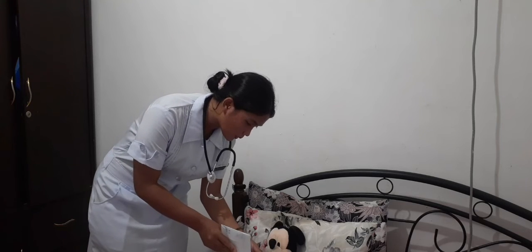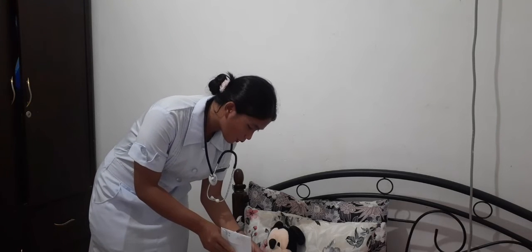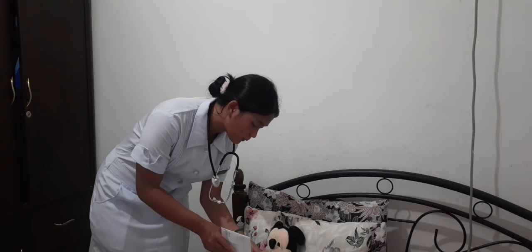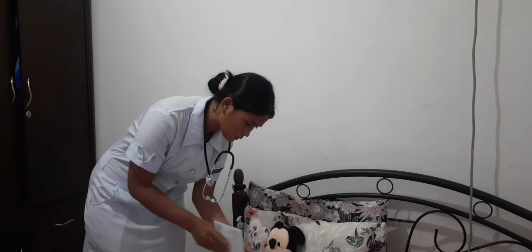Okay, ma'am, so you're going to seal your lips on the mouthpiece and you're going to inhale for 2 or more seconds until you elevate the balls, and try to hold your breath for as long as possible. And then exhale normally, and when you exhale, remove your mouth from the mouthpiece. Okay, can you try?